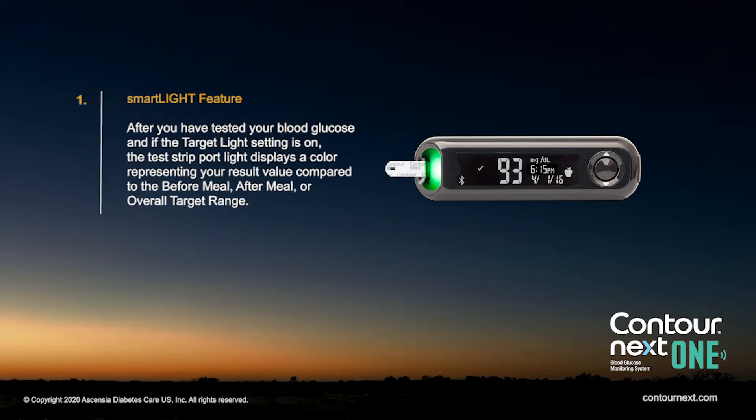After you have tested your blood glucose, and if the target light setting is on, the test strip port light displays a colour representing your result value compared to the before meal, after meal, or overall target range.